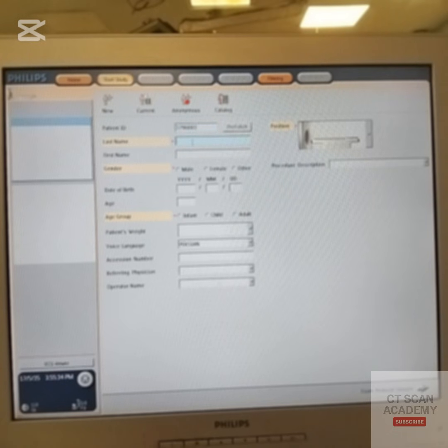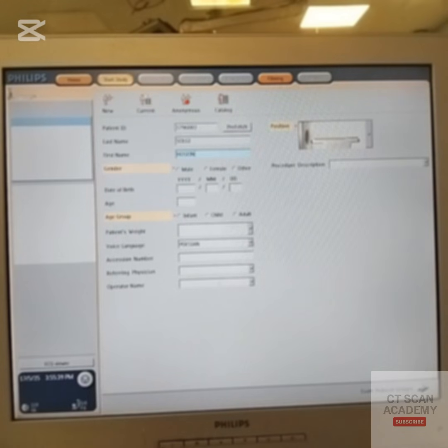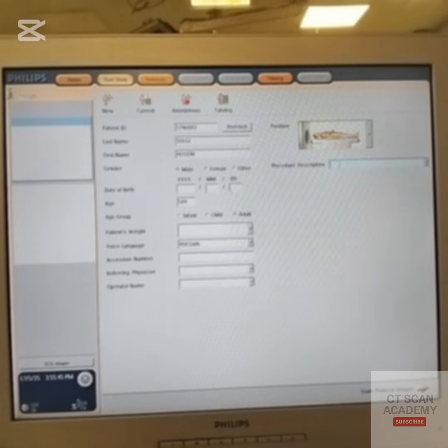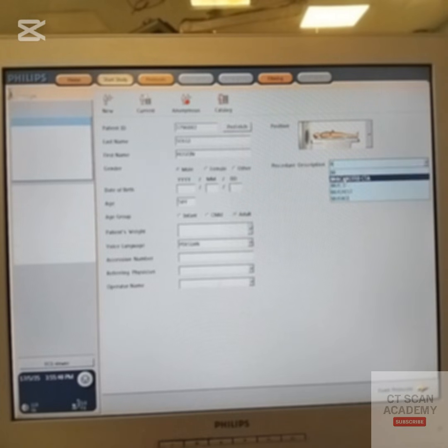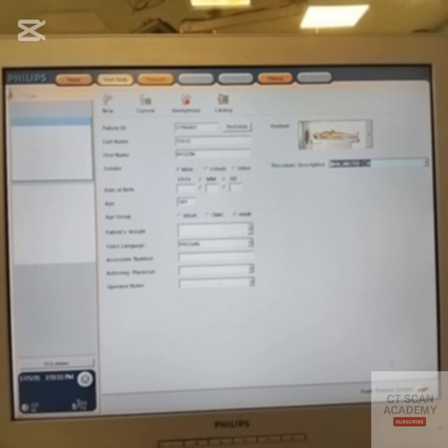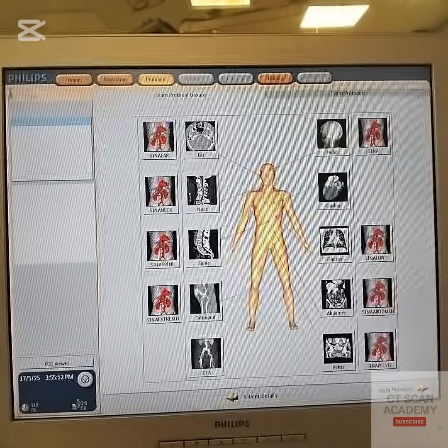As seen in the video, this scan was performed using a Philips Ingenuity 16-slice CT scanner. First, patient information is entered during registration. Ensure correct patient positioning is selected. All highlighted fields must be filled accurately. Patient data is blurred for privacy. Next, the appropriate protocol is selected.